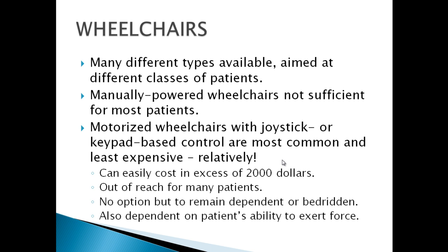In the case that they are not able to afford them, these patients may have to spend their time in bed or be dependent on a nurse. The operation of such wheelchairs depends on the ability of the patient to exert force to move the joystick or press the buttons on the keypad, and many patients may not actually have this faculty.